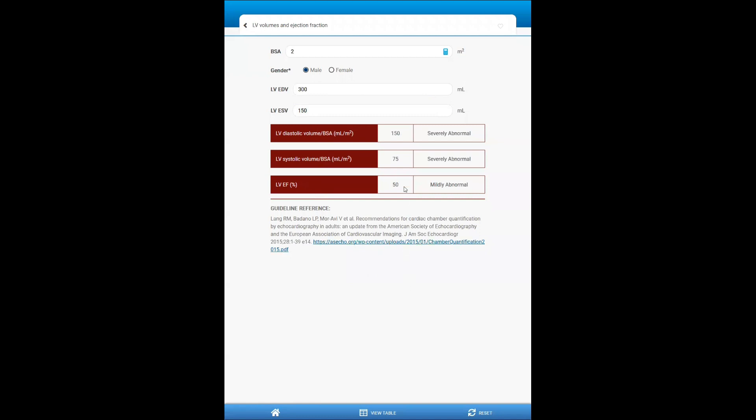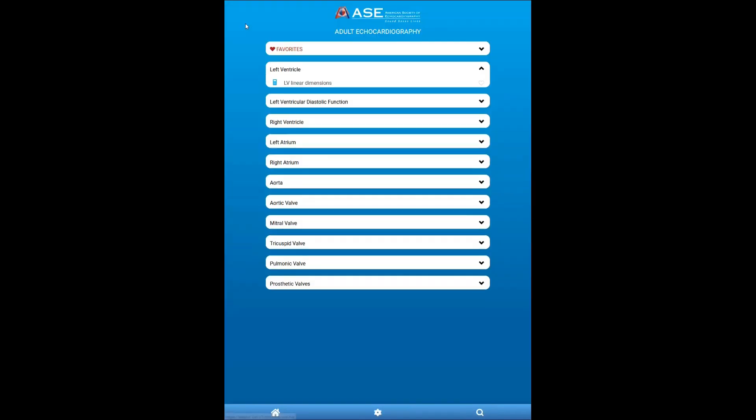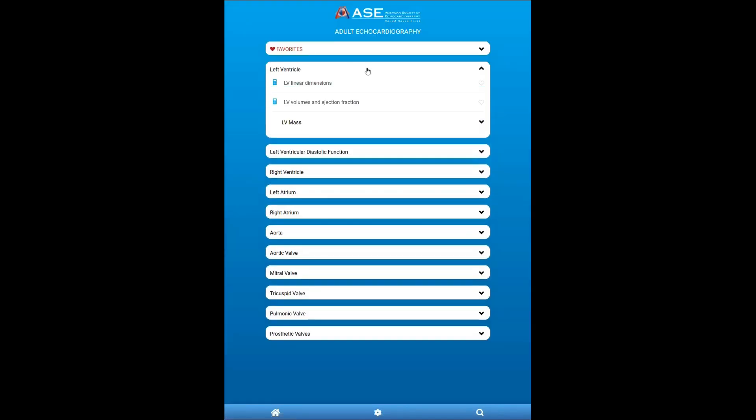And it will give me the ejection fraction, the index volumes, and whether these are normal or abnormal, and the degree of abnormality based on gender-specific parameters outlined in the guidelines reference here. So there are many calculators like this throughout the guideline.